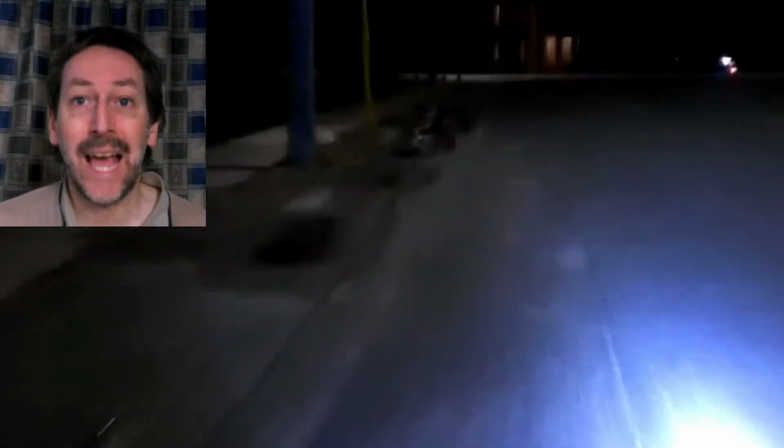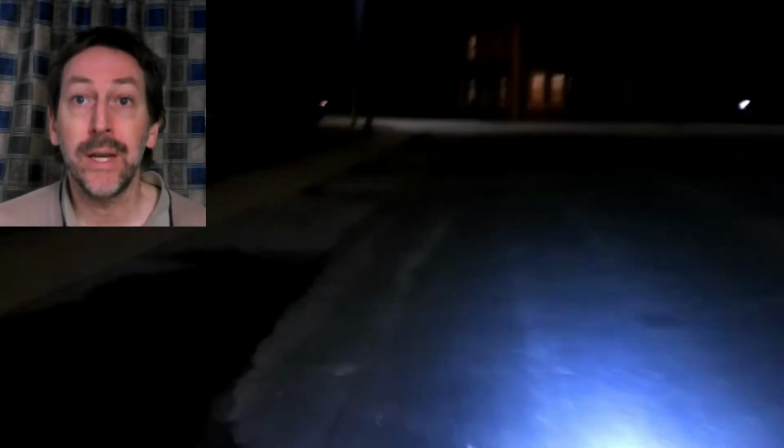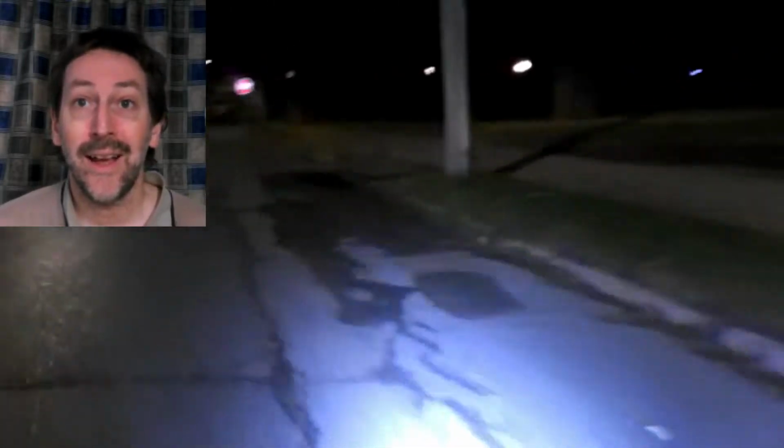Hi everyone. I'm making this video to talk about and show you what it's like having a white LED on your wheelchair. The white LED that's on in this video is on the right side of my wheelchair. I wanted you to be able to see the difference between having it on the right side and it not being there on the left side. I actually had a surprise.